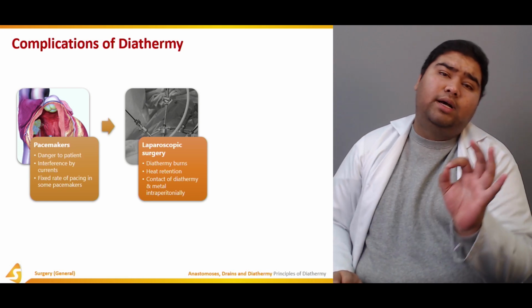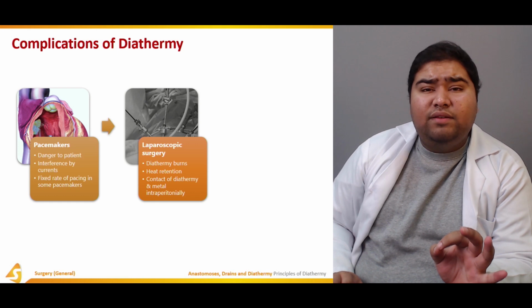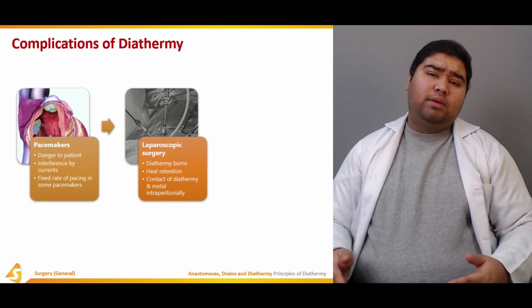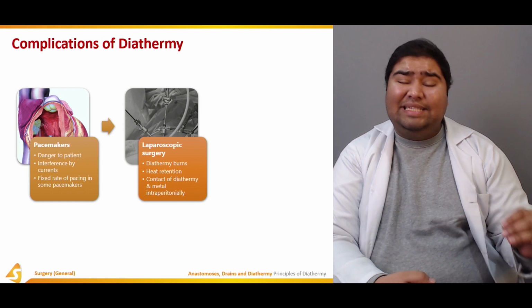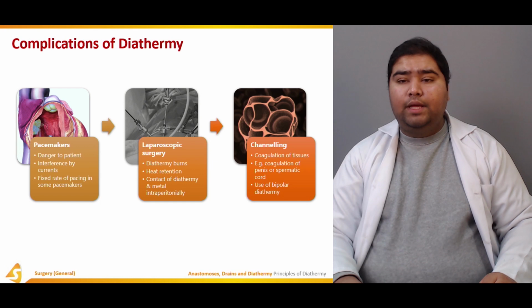Never press your diathermy probe before first finding it. Now, make sure your diathermy probe is not touching another instrument, another laparoscopic instrument, because when it's touching that instrument, it can also cause disastrous effects.